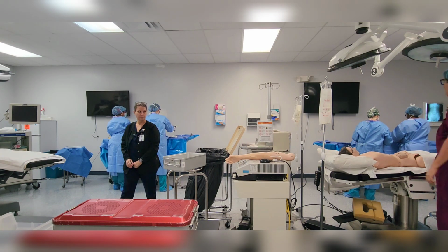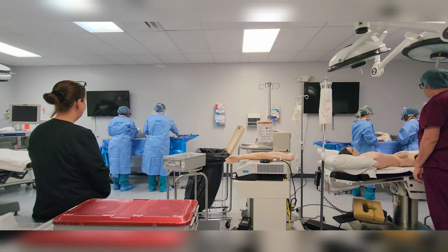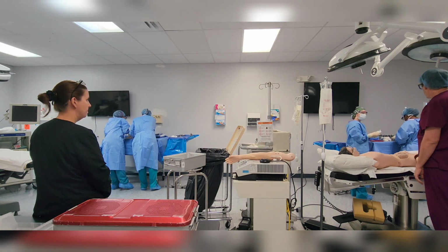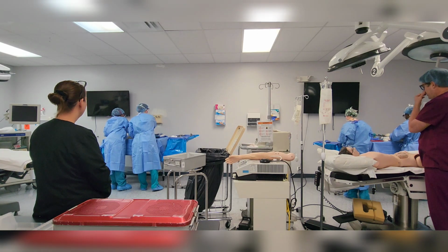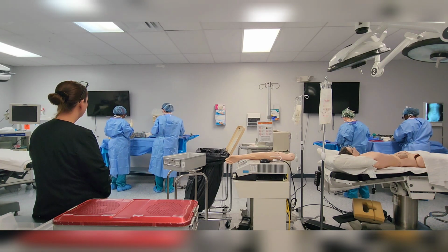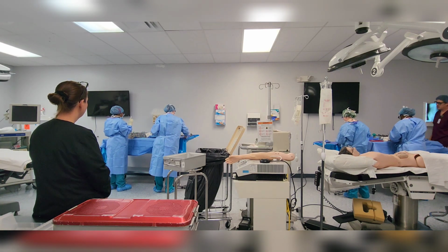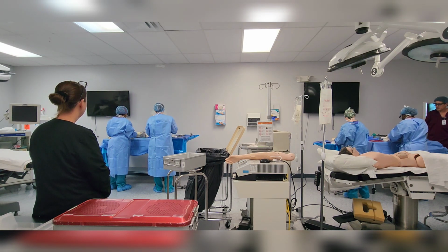In the future, I want to get you that set up for that open appendix. But make sure you just took it off the stringer and it's not on the towel roll, right? It's a hot mess. That's all I see. I'm starting to lose it, my eyes are twitching a little bit. So you take it off the stringer, because it's going to go everywhere. You're not going to have any control of that whatsoever, right?